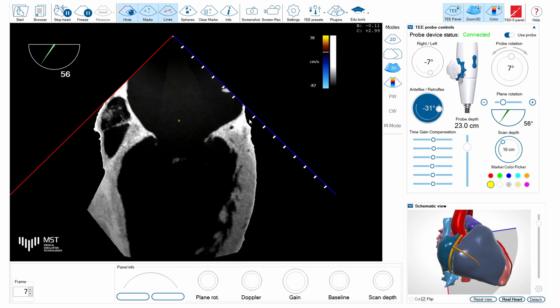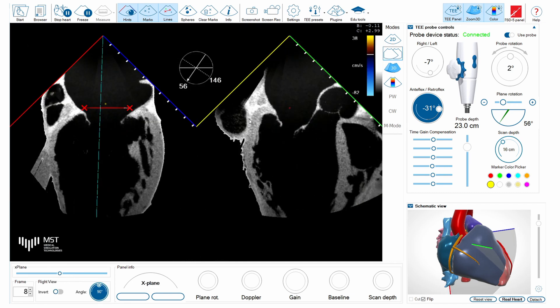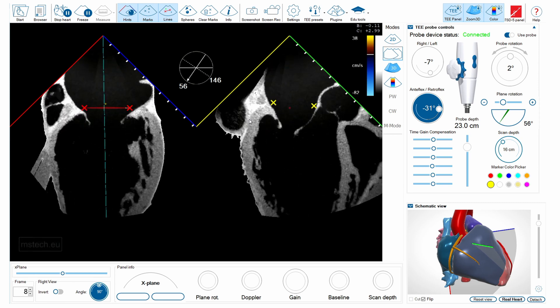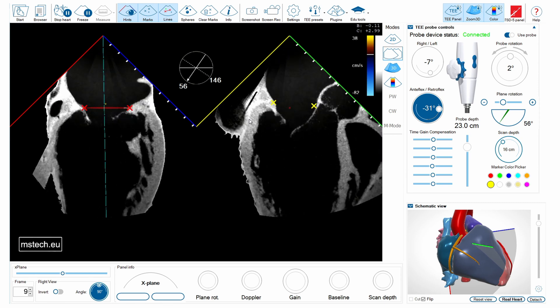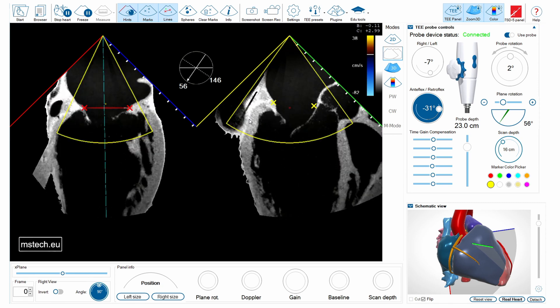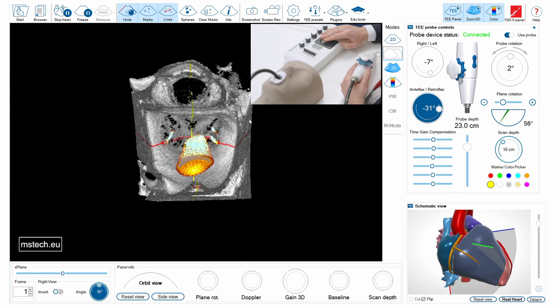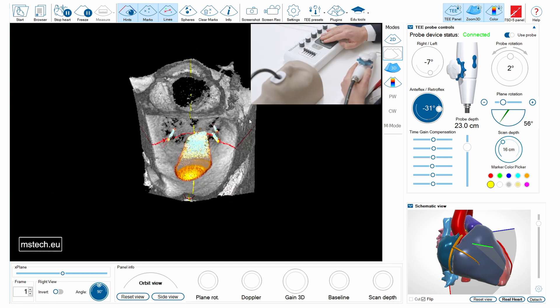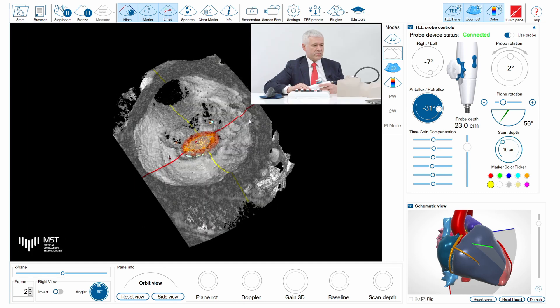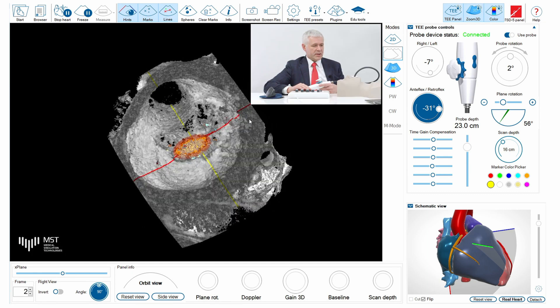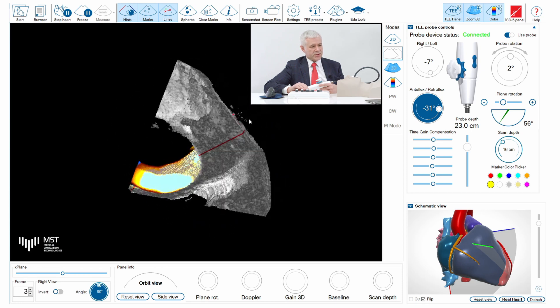I can show the mitral regurgitation in this case, and I can also switch to 3D mode and show this jet of functional mitral regurgitation in 3D space, both from the left atrial side and the left ventricular side.